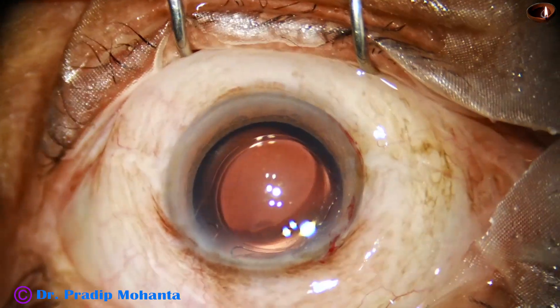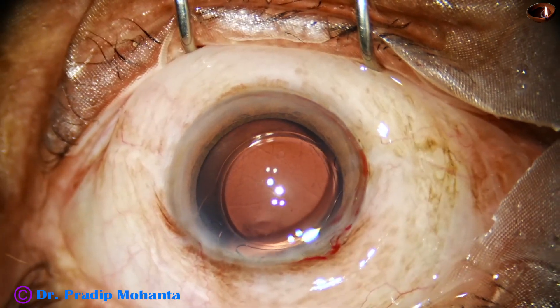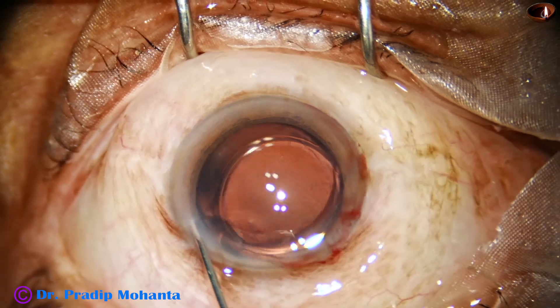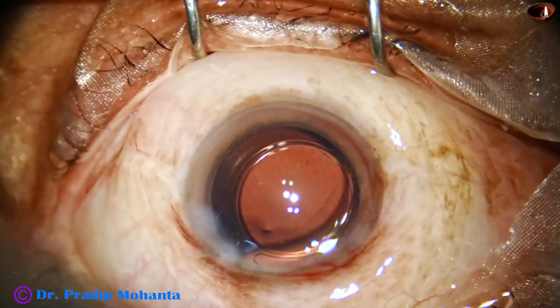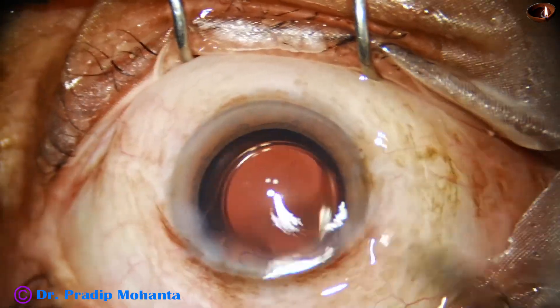And then a little bit of moxifloxacin is injected into the anterior chamber. The side port is hydrated. A final lavage is done. The anterior chamber is nicely formed and the case is concluded.